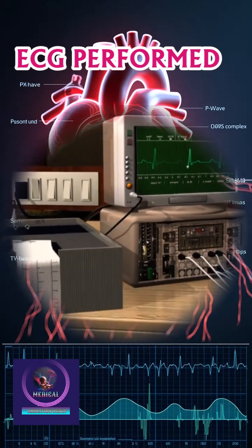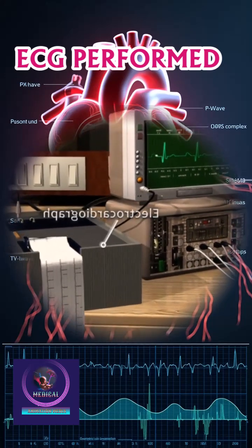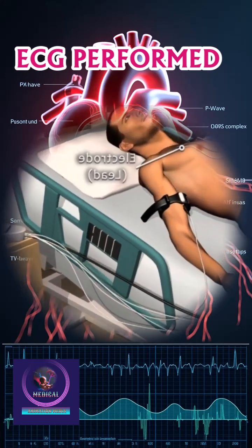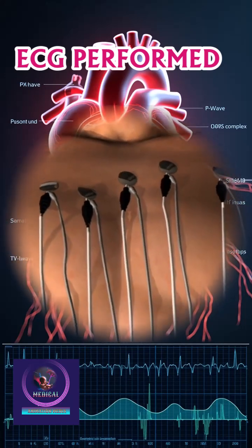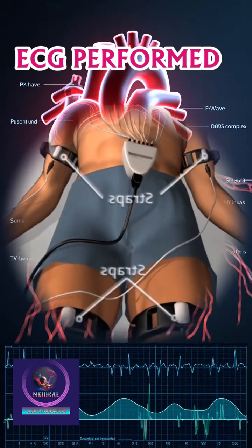To carry out this recording, a device called an electrocardiograph is used. It comes with electrodes, also called leads, that are attached to specific points on the chest using rubber suction cups, and to the arms and legs using straps.